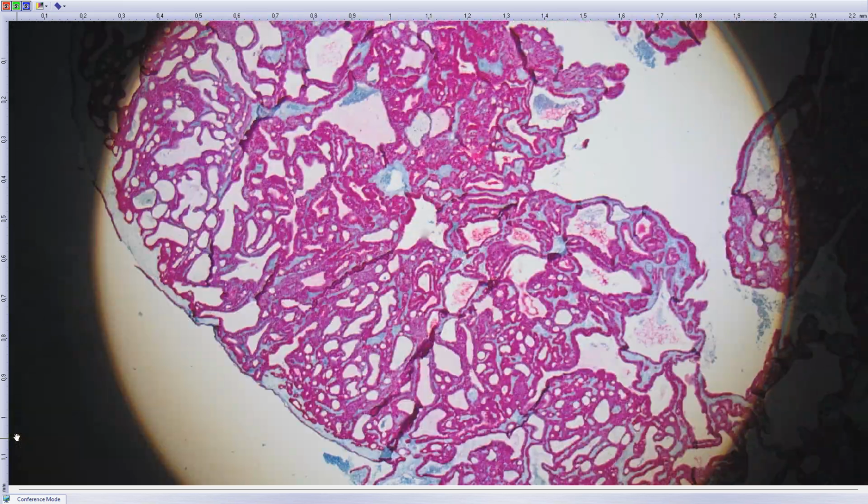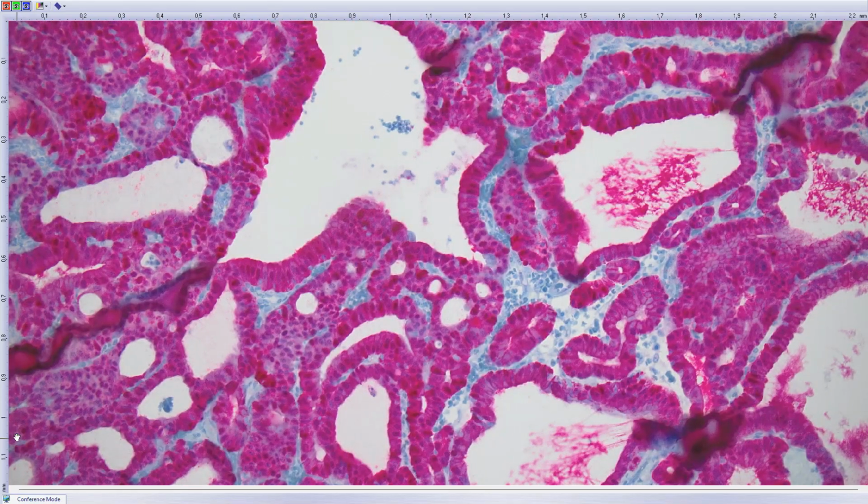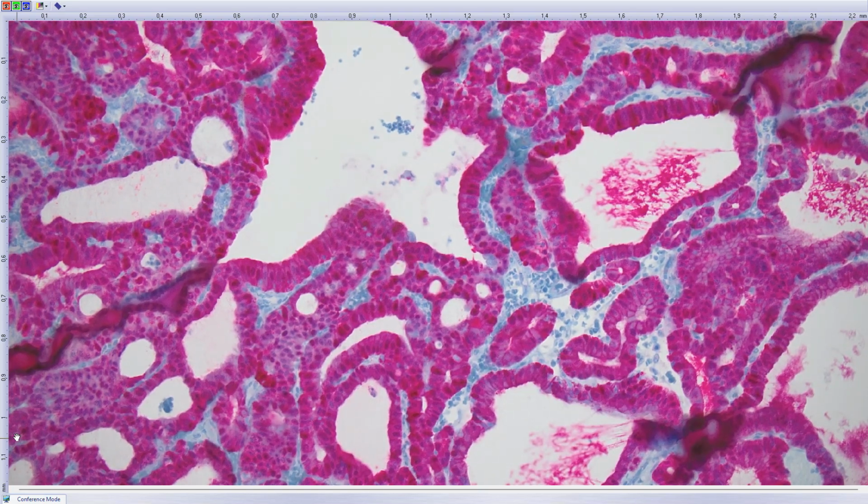But it's quite common to see pyloric gland metaplasia or hyperplasia, so it's the source for this kind of lesion. And one other marker, I forgot. This is beta-catenin staining, because something between 80 to 100% of cases show beta-catenin mutation, and you can see this nice cytoplasmic, but most importantly, nuclear beta-catenin staining. Okay. So this is a very nice example. So this was my warm up.